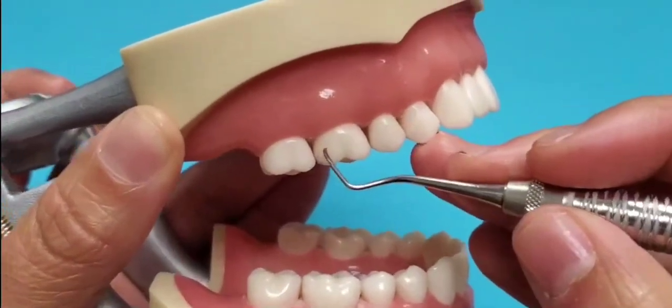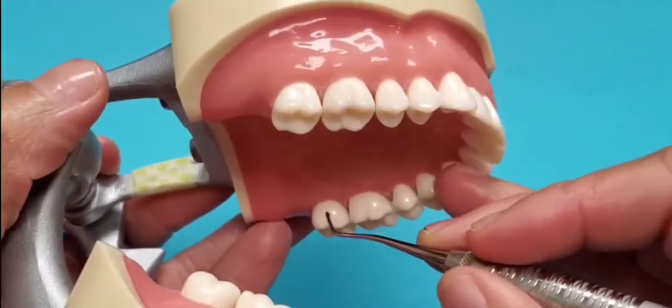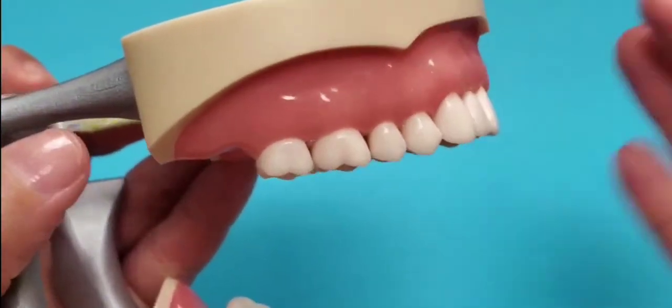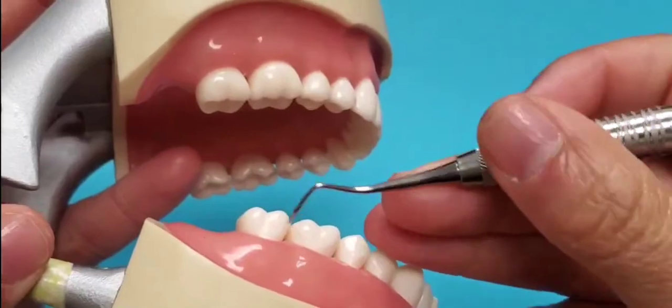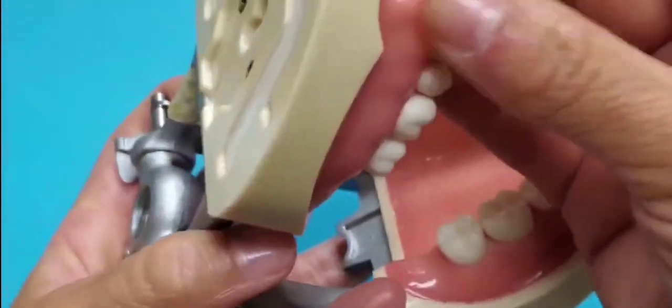The 6 end is correct for buccal of quad 1 and lingual of quad 2 — those two toward surfaces. You will use the opposite end for buccal of quad 2 and lingual of quad 1.